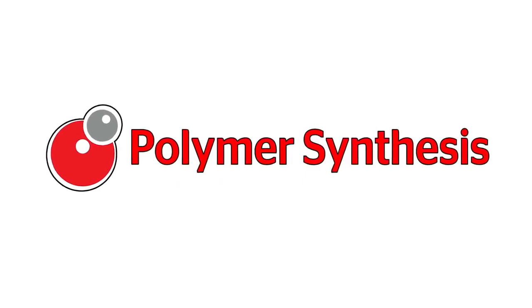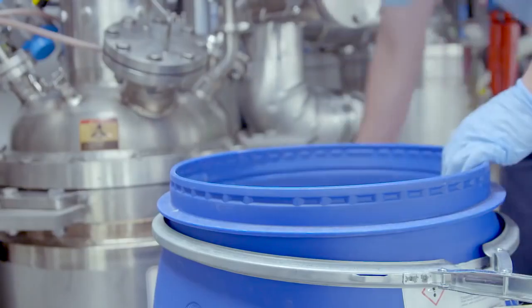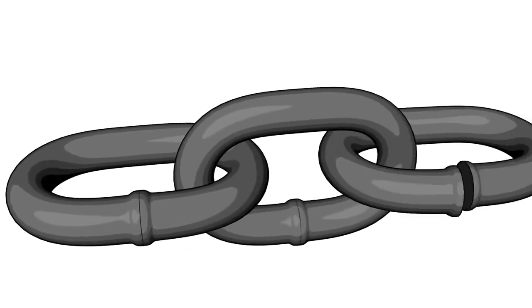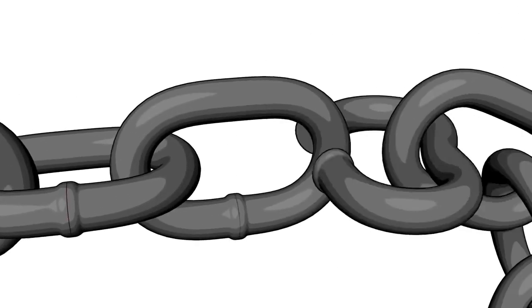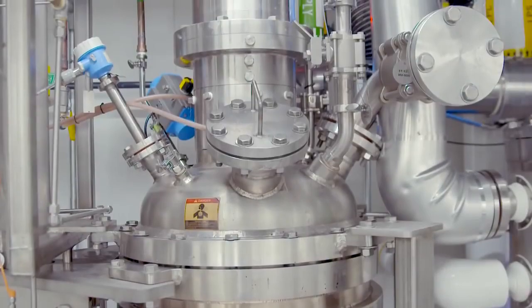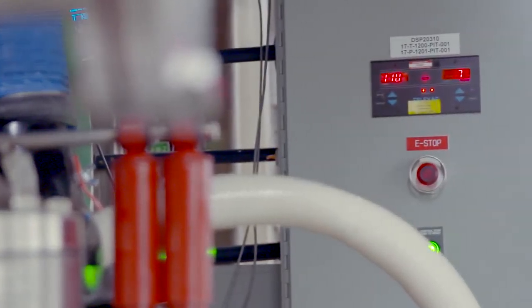The first step is polymer synthesis. This is when a monomer becomes a polymer. If you can think of a monomer being like a single unit, and then you take those monomers and you polymerize them and you build them into very, very long chains, that would be the polymer. So it means many units. Ethicon works with 4 different monomers that, when heated and combined into polymers, deliver different properties.